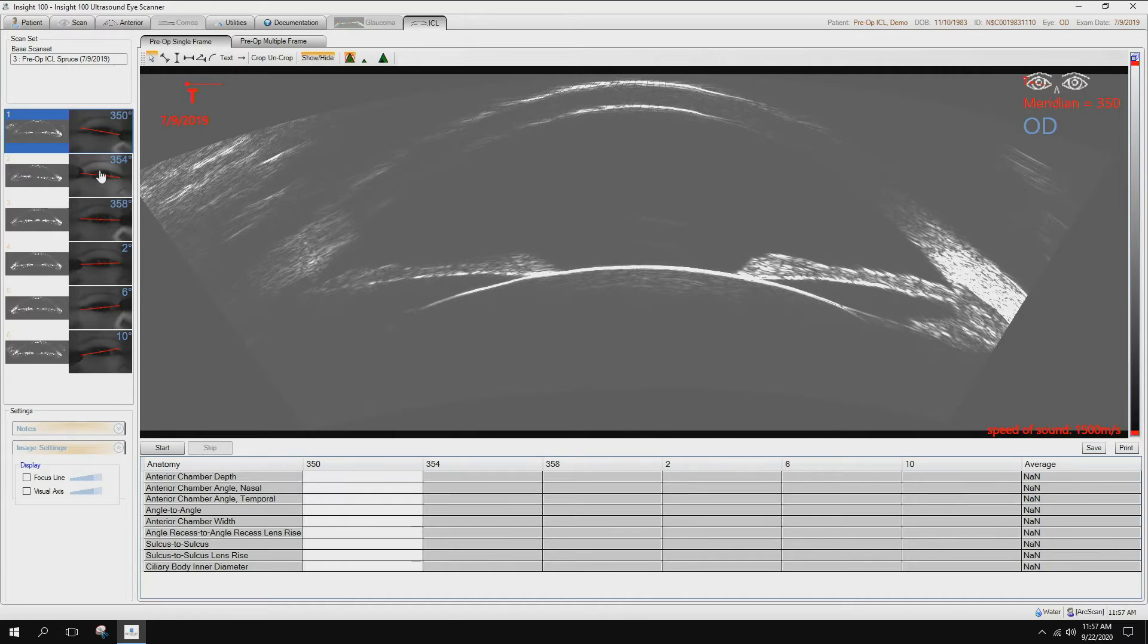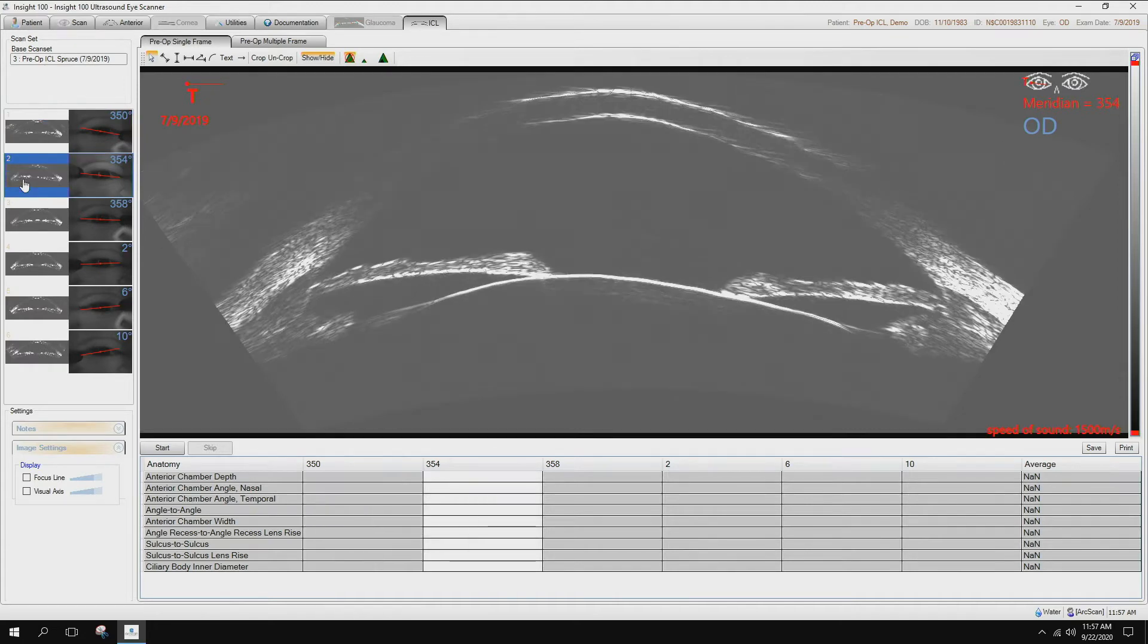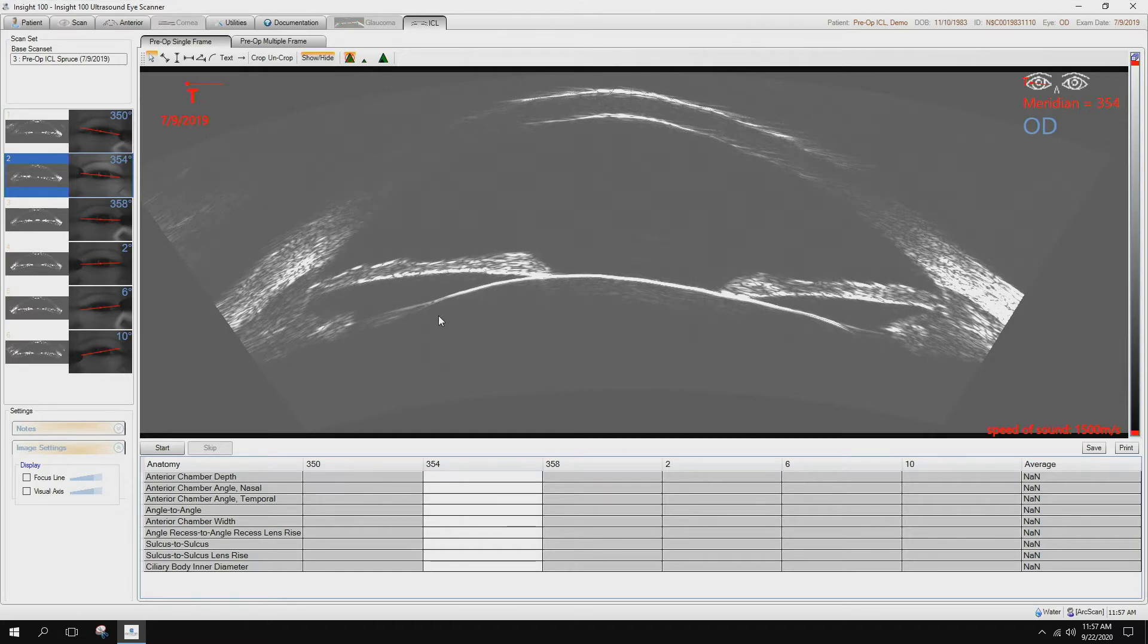We have multiple screens. We want to capture at least three of the meridians and take measurements on all three of those. So I'm going to just simply move beyond and just look at the other images here. Here we can clearly see all the structures necessary to take the measurements for the ICL sizing.